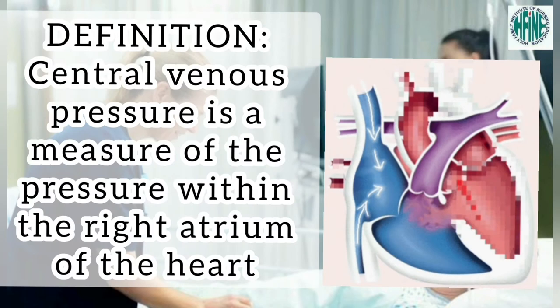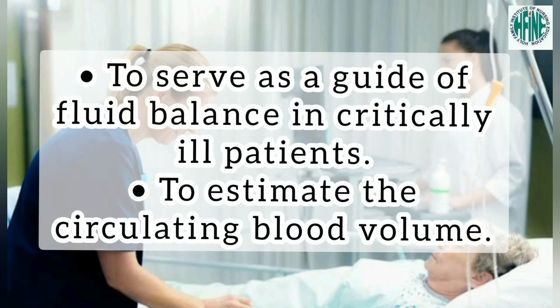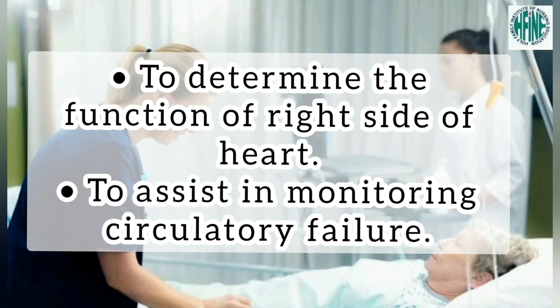Definition: Central venous pressure is a measure of pressure within the right atrium of the heart. Purposes: To serve as a guide of fluid balance in critically ill patients, to estimate the circulating blood volume, to determine the function of the right side of the heart, and to assist in monitoring circulatory failure.